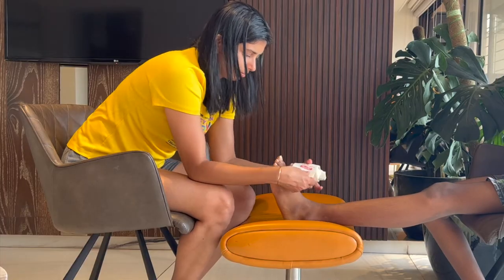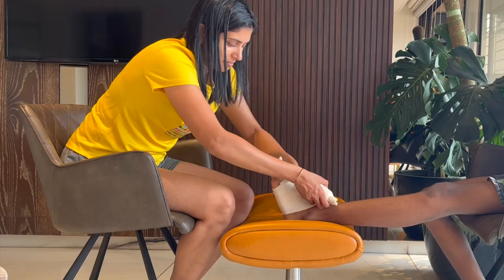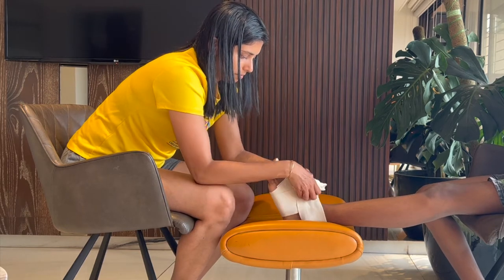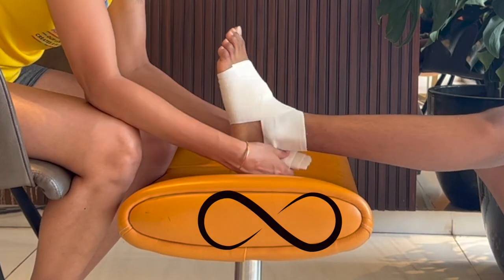For the ankle joint, you start with wrapping just below the toes. Make sure the ankle is in neutral position — that means the toes are pointing upwards. After doing a couple of circles, we will continue with the figure of 8 pattern.